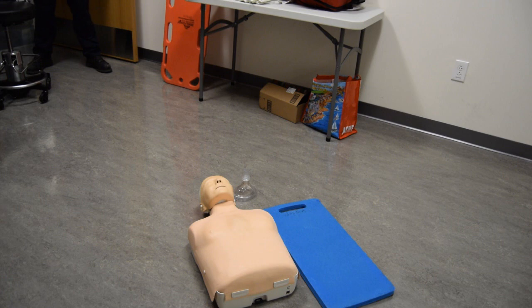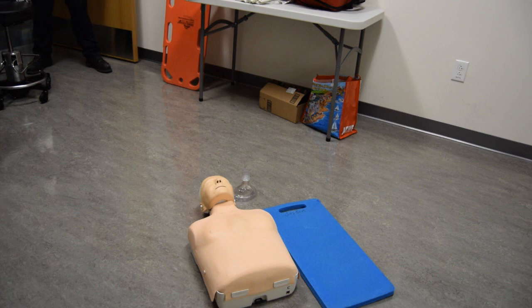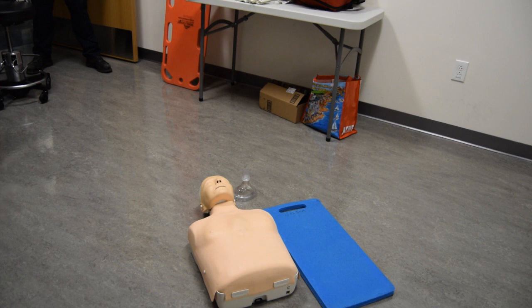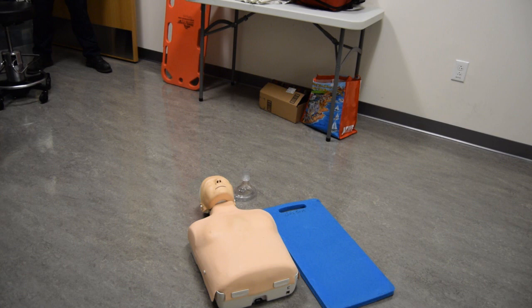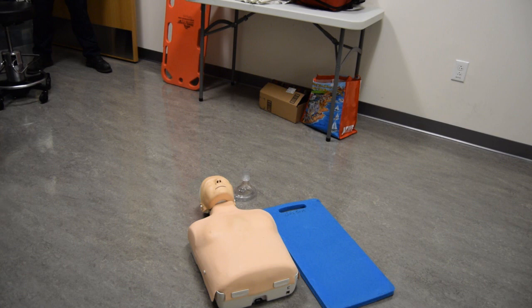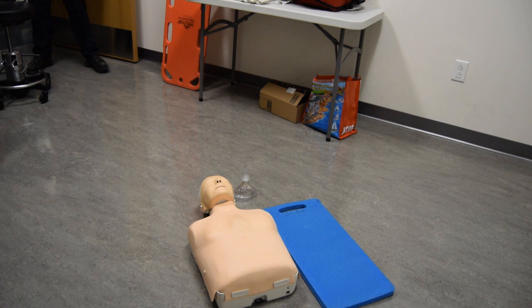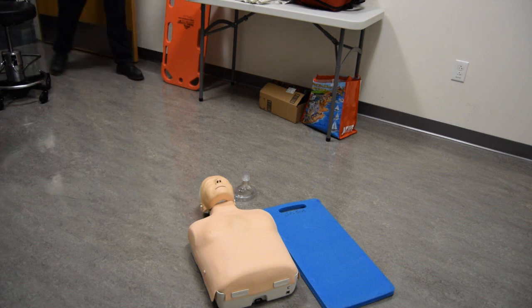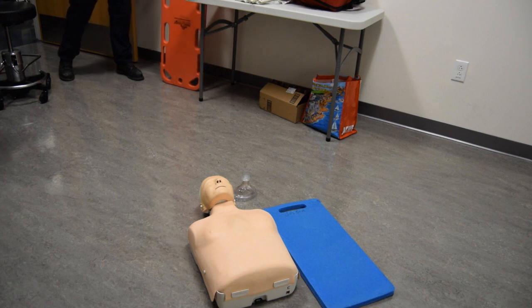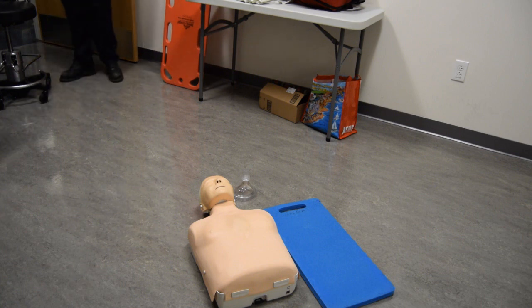You arrive on scene by yourself and there are no bystanders present. You must begin resuscitation of the patient in accordance with current American Heart Association guidelines for CPR. You must physically perform one rescuer's CPR and operate the AED, including delivery of any shock. Please take a few moments to familiarize yourself with the equipment before we begin, and I will be happy to explain any of the specific operational features of the AED.